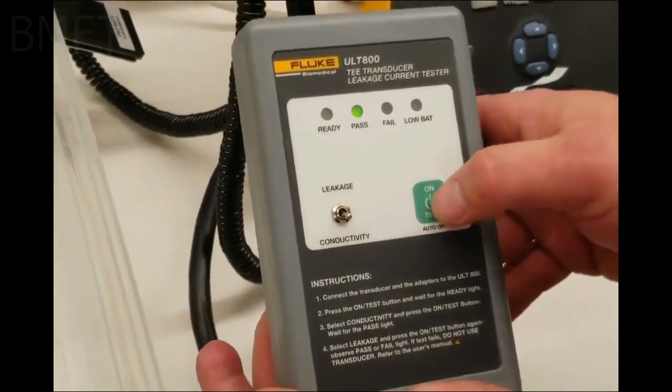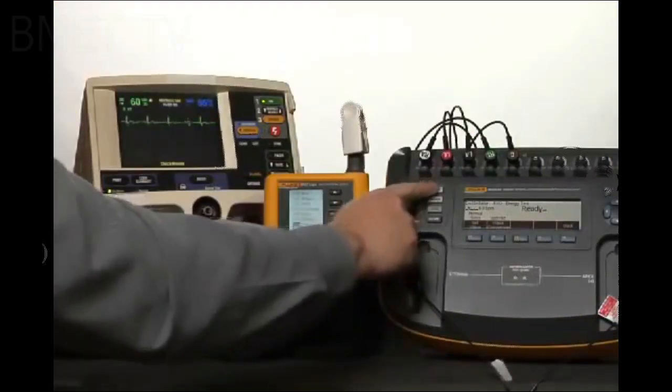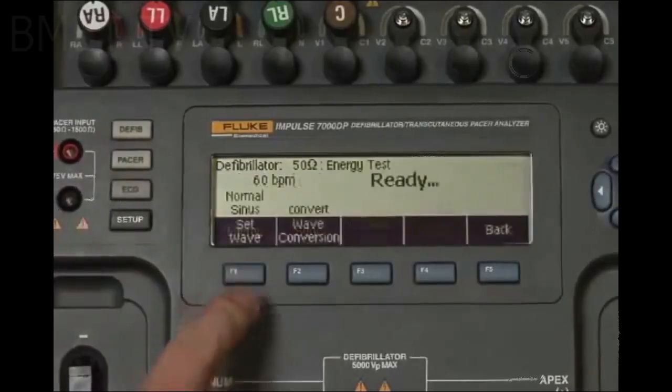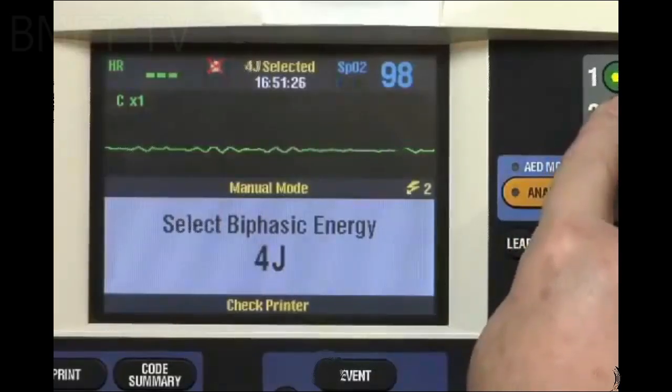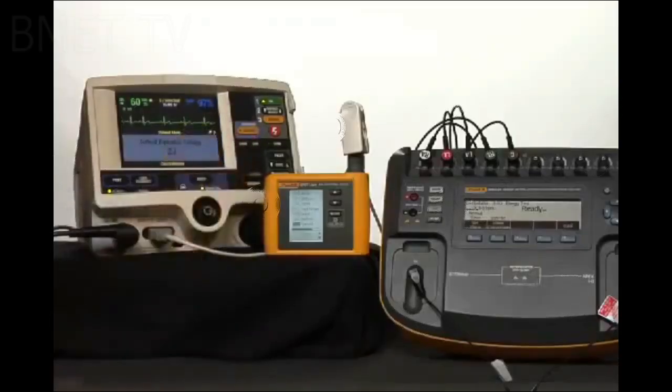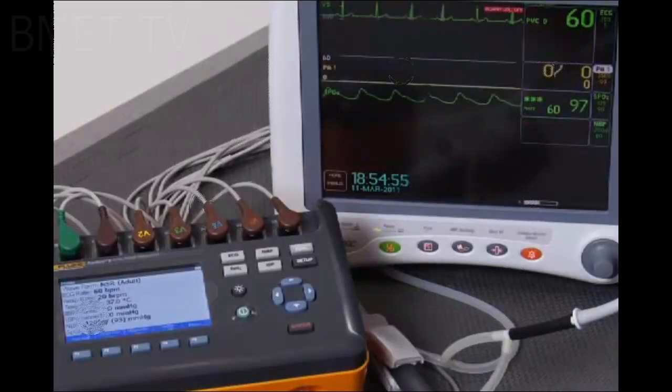To help verify the functionality and safety of medical devices, electrical safety standards have been established in the United States, European countries, and other parts of the world. The standards differ in criteria, measurements, and protocol. The International Organization for Standardization, ISO, and the International Electrotechnical Commission, IEC, organizations based in Europe, provide standards worldwide in partnership with the World Trade Organization. These include standards for electromedical equipment.